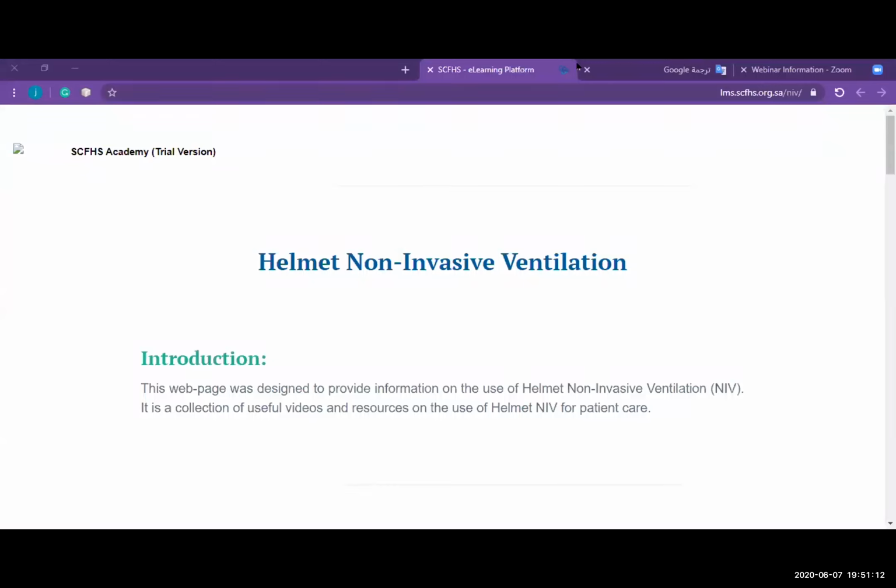HME and the helmet, it has to be in a special connection way. The whole idea is that you don't want to communicate your inspiratory limb and expiratory limb, just for the sake of infection control purposes. So the ideal setup with HME is not yet determined.